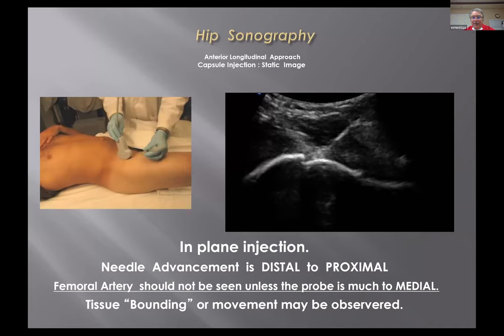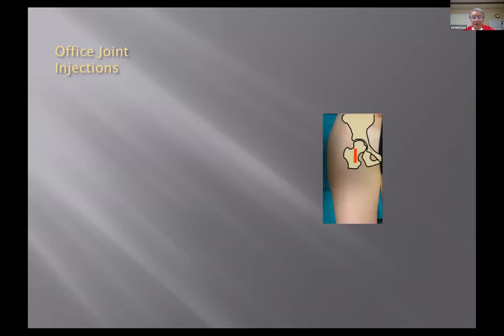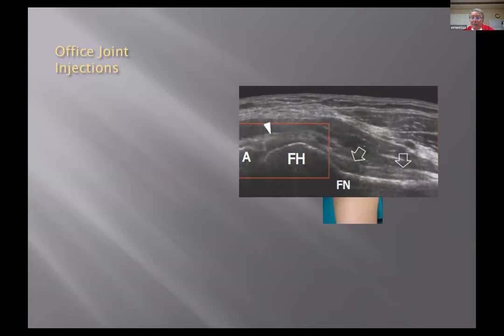And this is just an example. So this is what I do 10 to 15 times a day in the office. I inject their hip. Nobody's put a shot in their hip. Everybody's had shots in their side, in their butt. Their pain management guy's done this and that. I say, anybody put a shot in your hip? And you can see the needle going right in the joint. This is stupid simple. I do a bunch of these. And when their pain goes away with an office injection, these people are your happiest people.